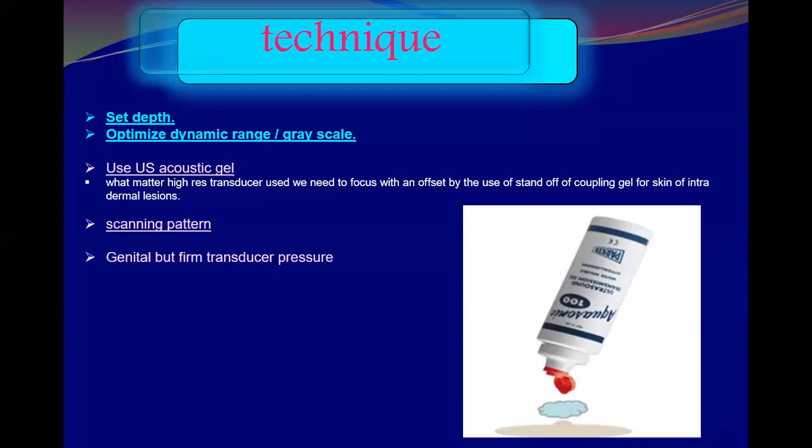After we know how to optimize space and position, we know to scan the breast from the clavicle down until no breast tissue can be seen inferiorly or caudally, laterally going to the mid-axillary line, medially to the midline, where the two breasts are abutting each other. Then we would like to know what the techniques are to image a breast.